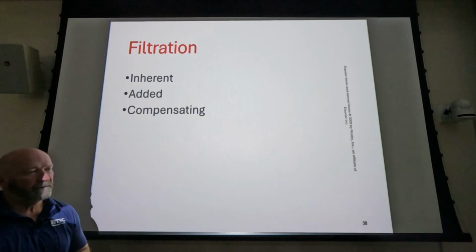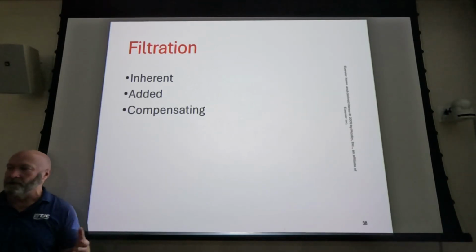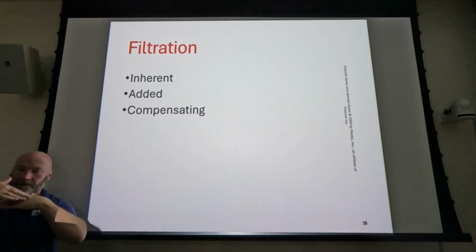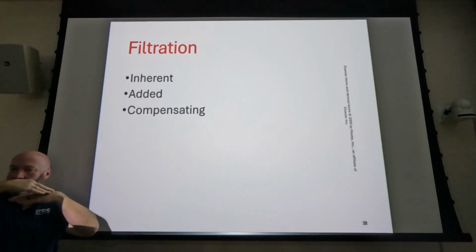So what we would do, for those wedge-shaped structures like feet and T-spine, is use a compensating filter. A compensating filter compensates for tissue density differences that would interfere with being able to make a diagnosis across the entire anatomy. Okay, so your foot being wedge-shaped, the proximal end of your foot towards your heel is going to absorb more X-rays than the toe end, right?